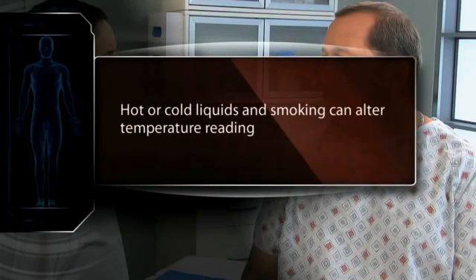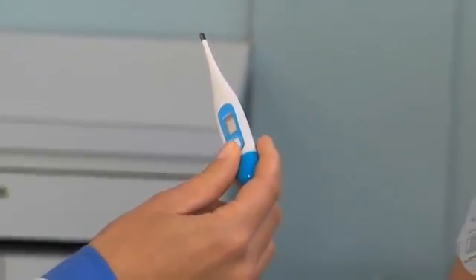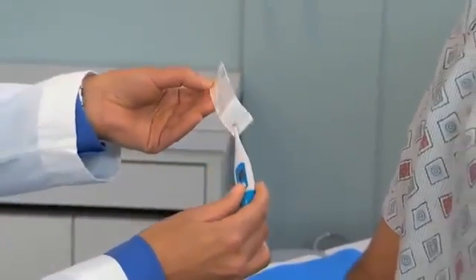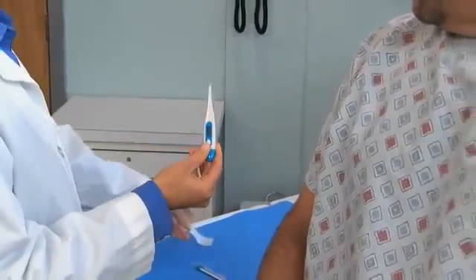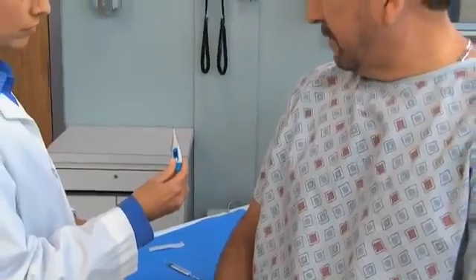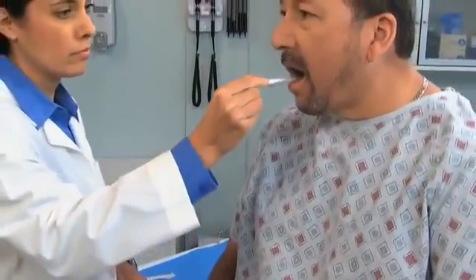If the temperature continues to rise, repeat the procedure until the reading remains stable. Note that hot or cold liquids, or even smoking, can alter the temperature reading, so in these cases, it is best to delay measuring the temperature for 10 to 15 minutes. Electronic thermometers are increasingly replacing glass thermometers. To use this device, carefully place the disposable cover over the probe. Insert the thermometer under the tongue and ask the patient to close both lips, and then watch closely for the digital readout. An accurate temperature recording usually takes about 10 seconds.